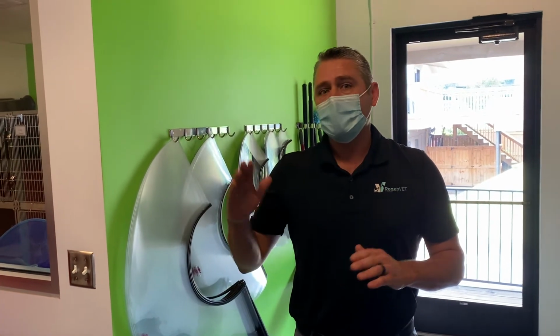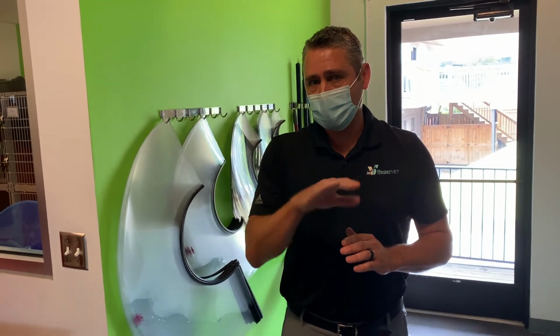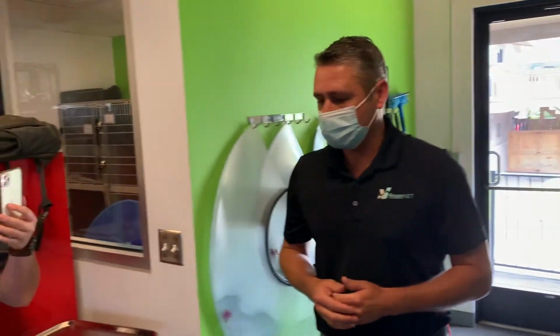Once that's done, it will slowly speed down, and it won't come to an abrupt stop because we don't want to mess up the buffy coat. And then the top will open, and we'll take our blood out and proceed.